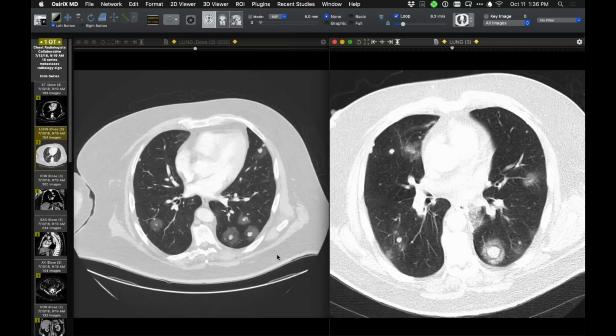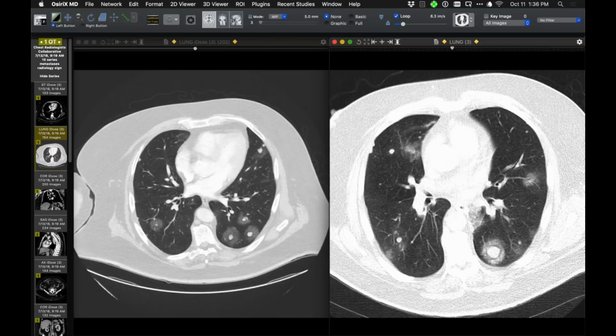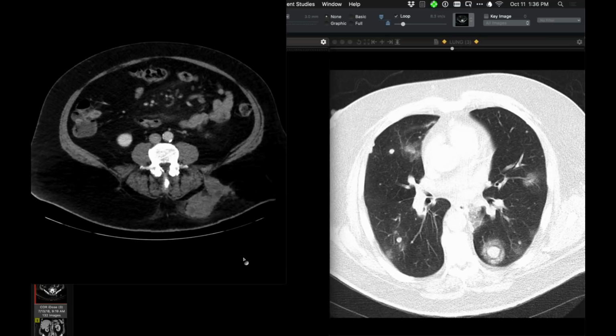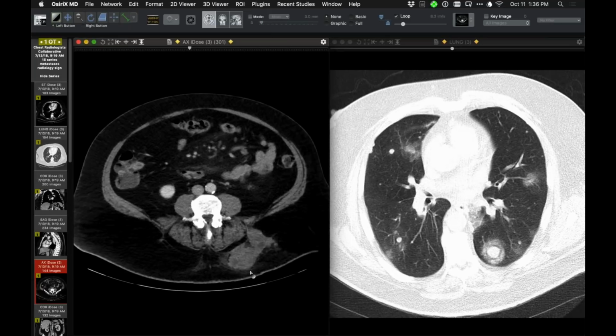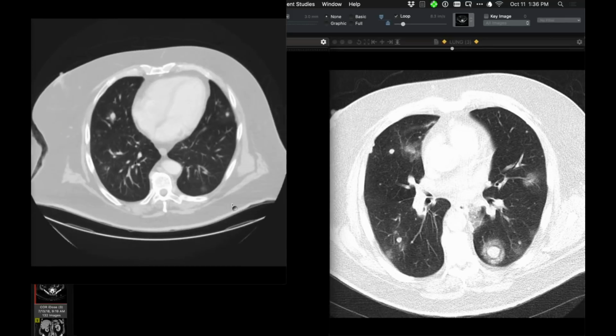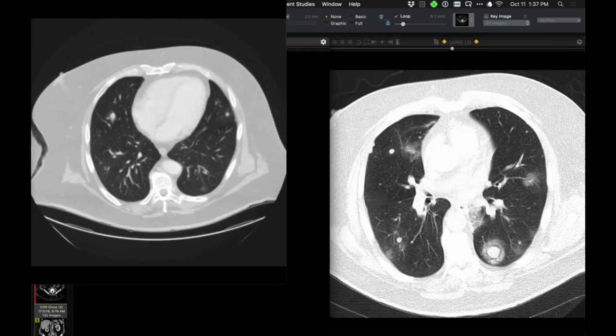No, I don't know. This poor guy did have recurrent metastatic melanoma to other sites. He had a biopsy proof from an abdominal mass, so we definitely know he's got metastatic melanoma. We don't have a biopsy of the lung, but he had this biopsied here, and that was the source of the diagnosis of recurrent and metastatic melanoma. So I'm pretty sure that's what it is. And these have grown over time, as you can see. So a pretty dramatic case of kind of a target lesion in a way, with the CT halo sign, I think it's called.